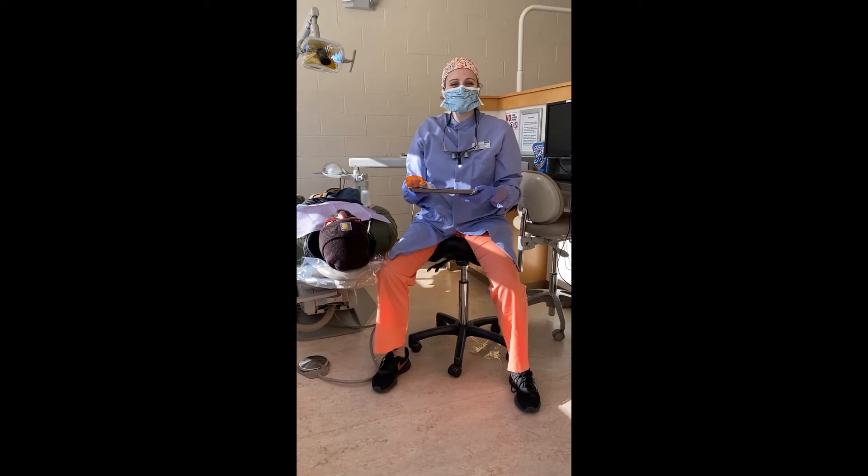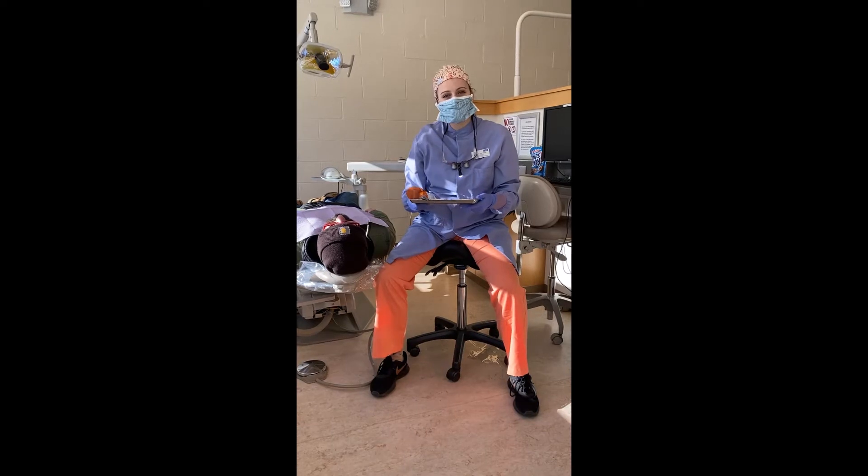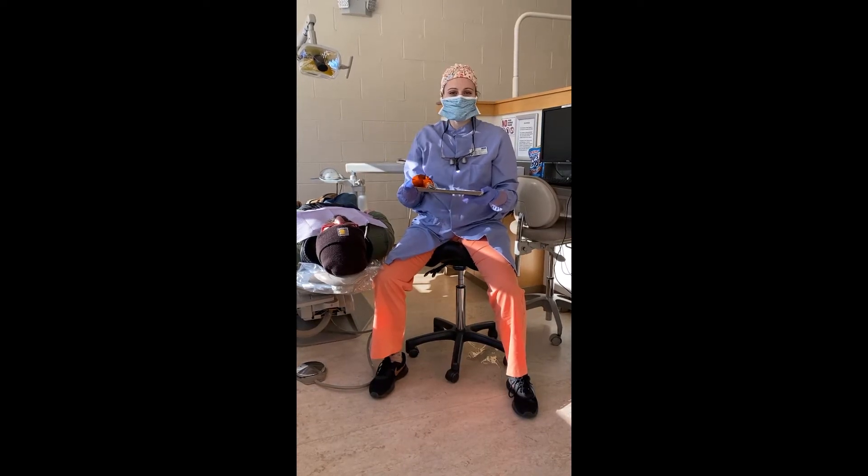Hey everybody, Fraser Drell here. I am going to run you through how to properly perform a dental sealant.